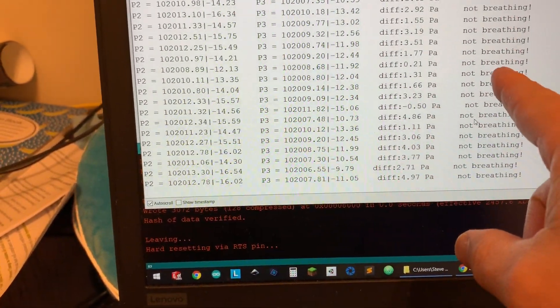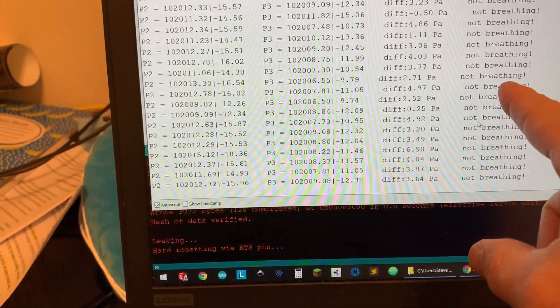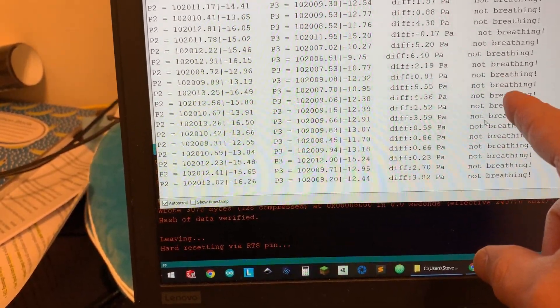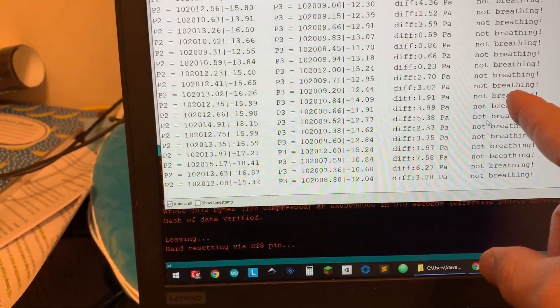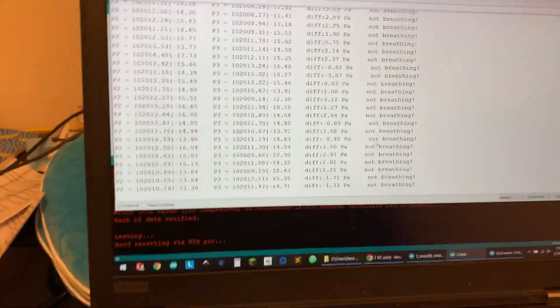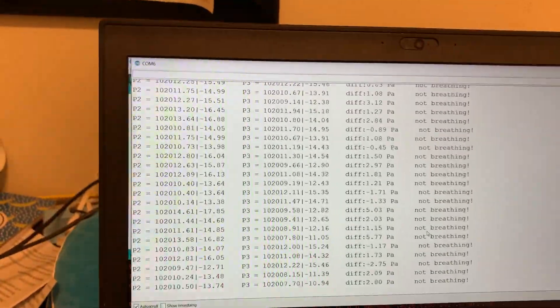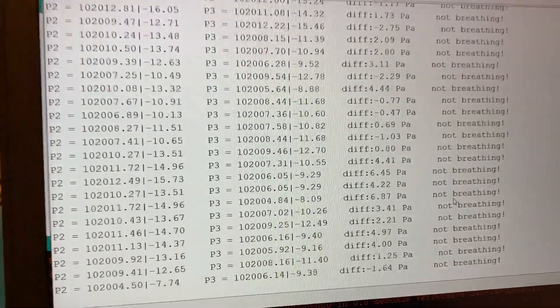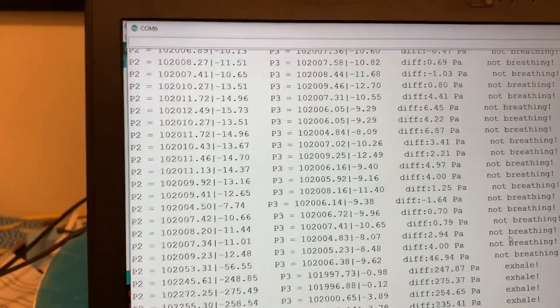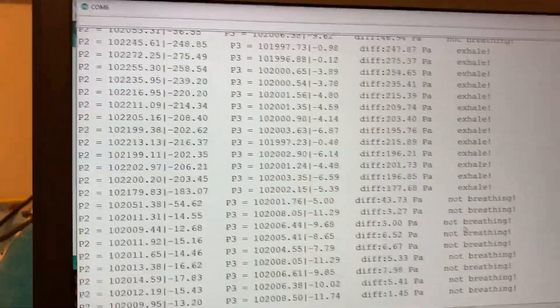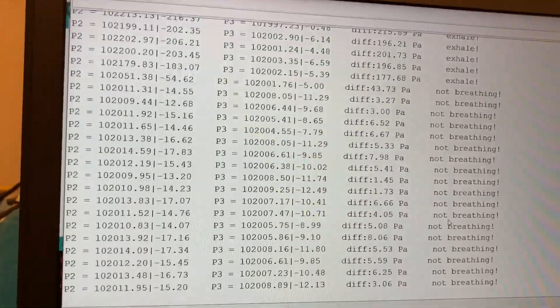And then finally, we've got whether I'm inhaling, exhaling, or not breathing. And so I'm going to see if I can do this without unplugging it. That was me exhaling.